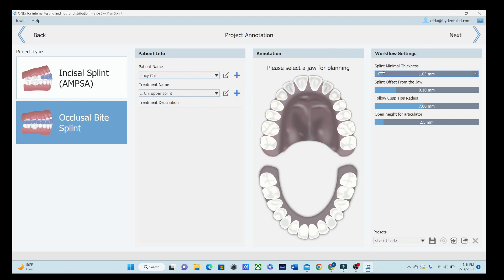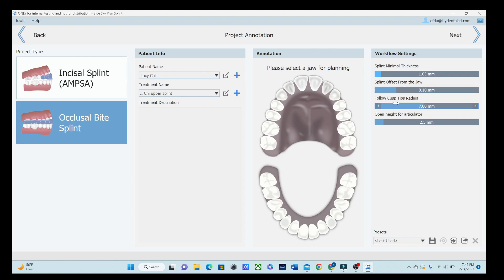Next thing, splint minimal thickness. When I opened this up, it said 3 millimeters. I changed it to 1 millimeter, 1.03 last time, and it saved those settings, which is really nice to see. Splint offset, 0.10 millimeters, which is what I always do. So follow cusp tips to radius, 7 millimeters. We will be able to adjust that later. But let's go ahead and select the upper jaw that we'll be doing. I like all of that. That was what I did last time.